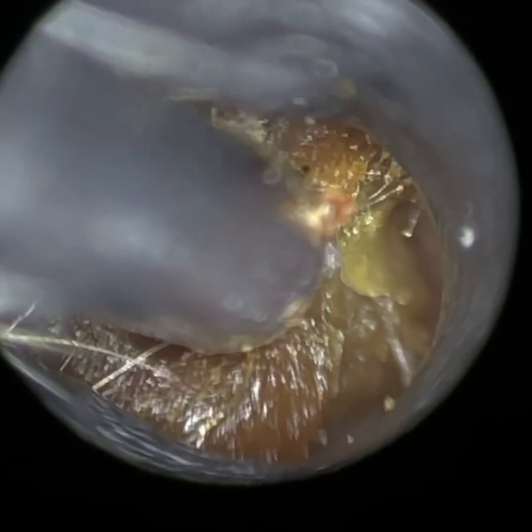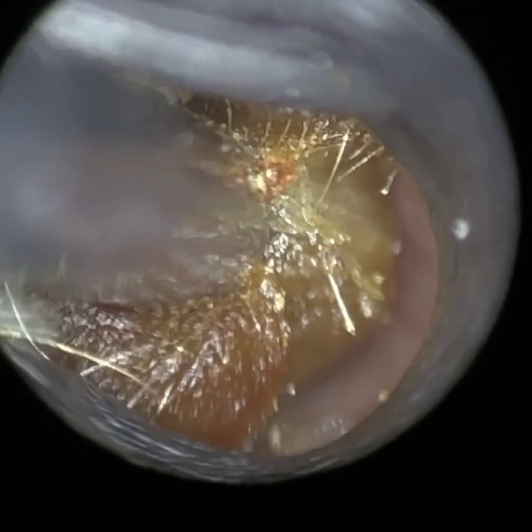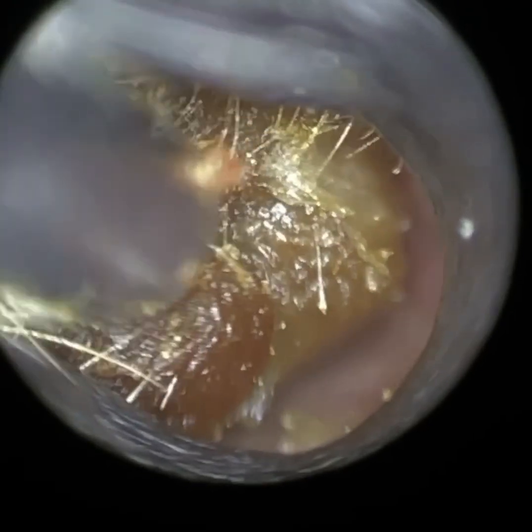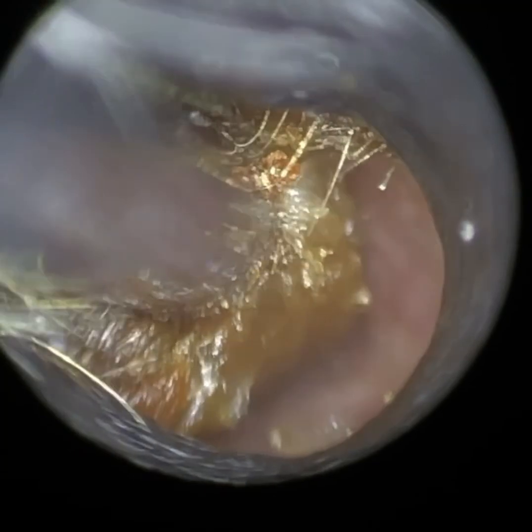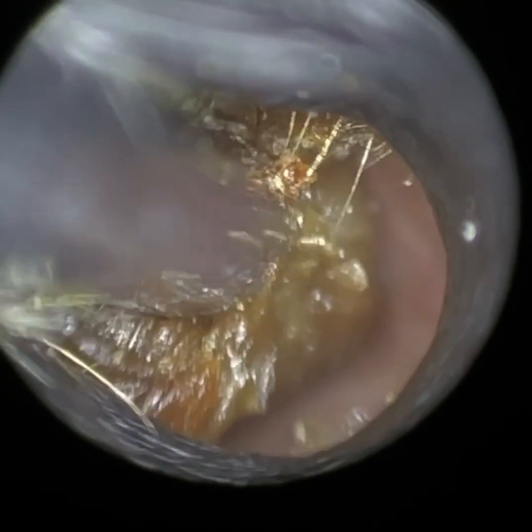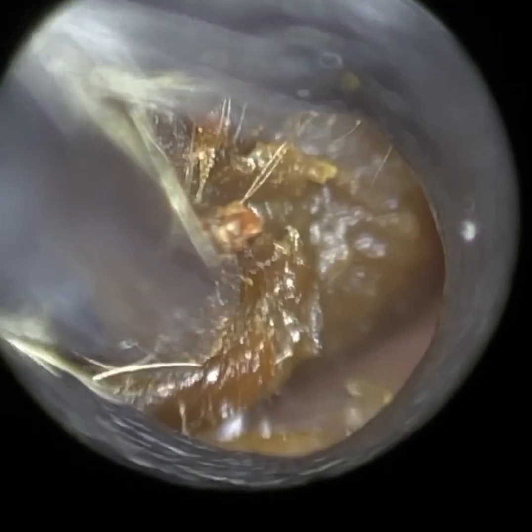In the right ear, it was just about narrow enough to dilate the ear canal. But if you continue watching in the left ear, I had to revert to our smaller speculum — the 3.5mm speculum — just to be able to insert it into the ear and dilate it enough to visualise the wax.